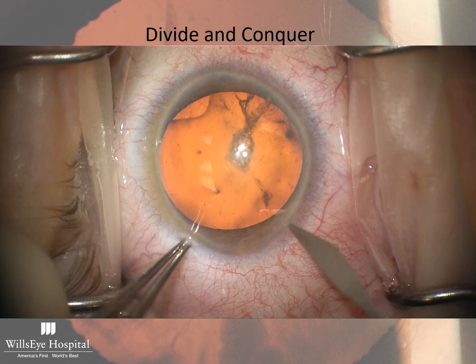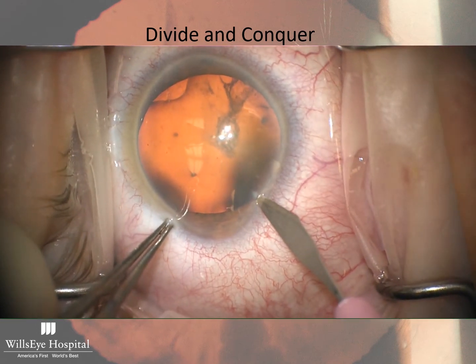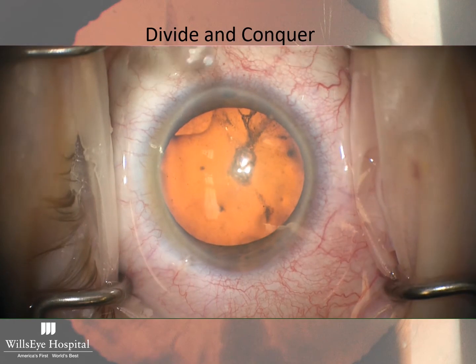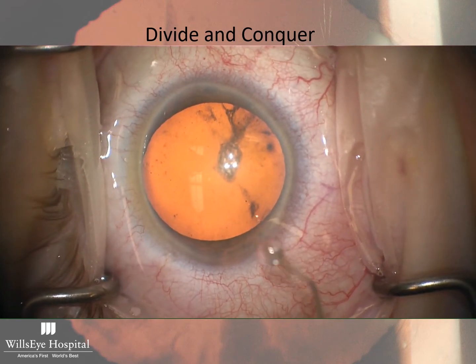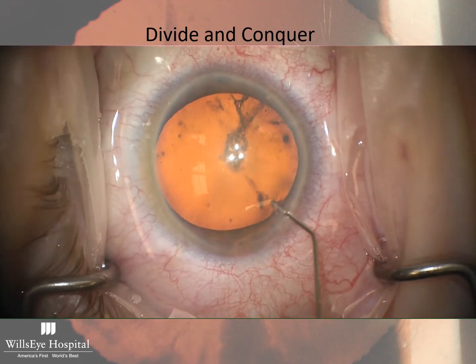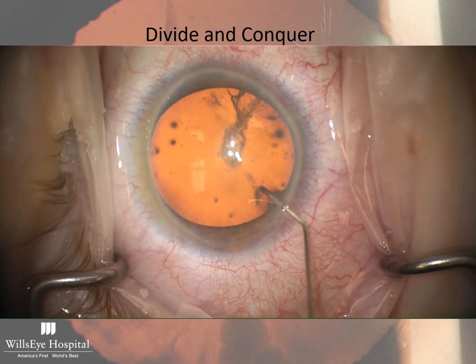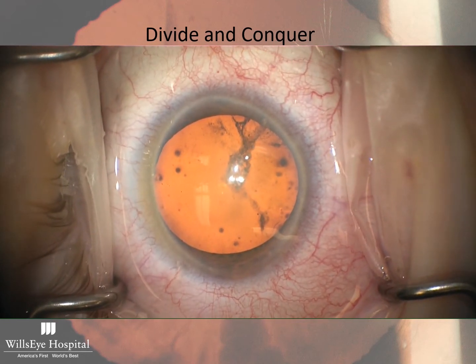So here is a real-time video of divide and conquer cataract surgery. I'm a left-handed surgeon, so I'm creating a paracentesis for my non-dominant or my right hand, approximately 40 to 45 degrees away from where my main wound is going to be. I'm injecting intracameral anesthetic. I usually use sugarcane, although this patient is maximally dilated, so not really additional need for that at this point in time.